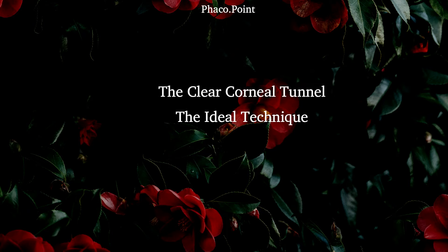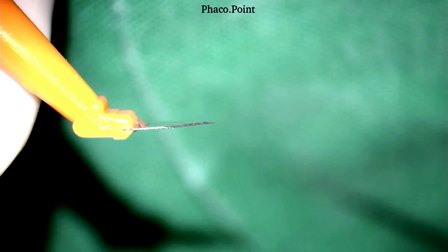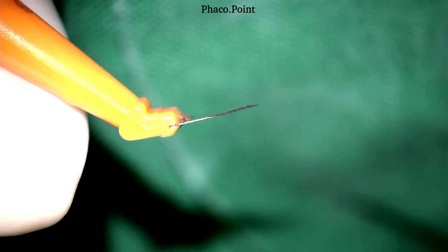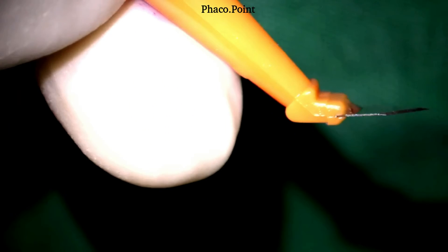Let's now learn how to make the perfect clear corneal tunnel. I typically make a biplanar incision. A biplanar 2.8mm by about 2mm incision works perfectly well during nucleus disassembly and IOL insertion and is a self-sealing incision. Here's how it's made: I hold the blade at the limbus, press down and engage into the cornea, then turn the tip upwards and traverse the cornea about 2mm. Once I've acquired the adequate length, I straighten the keratome and pierce Descemet's membrane, entering the anterior chamber until the parallel parts of the blade proximal to the shoulder have entered, then withdraw the keratome avoiding any slicing movements either on the way in or the way out.